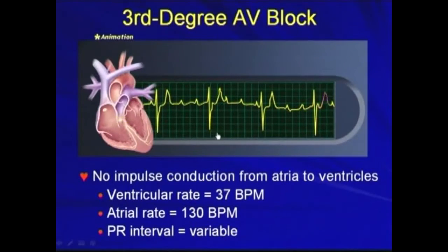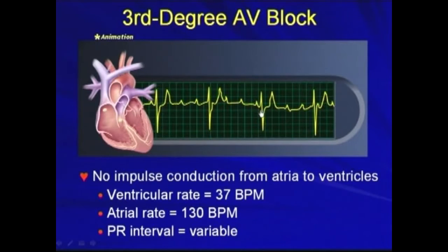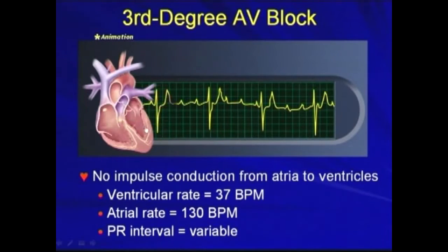Here the ventricular rate is only around 37 beats per minute, while the atrial rate is actually 130 beats per minute. The PR interval is variable because there's no relation between the P wave and the QRS complex, as there's a complete block in the AV node — so it's a complete dissociation.